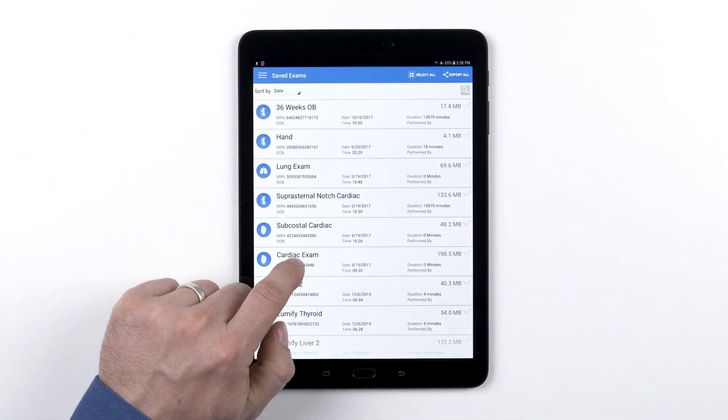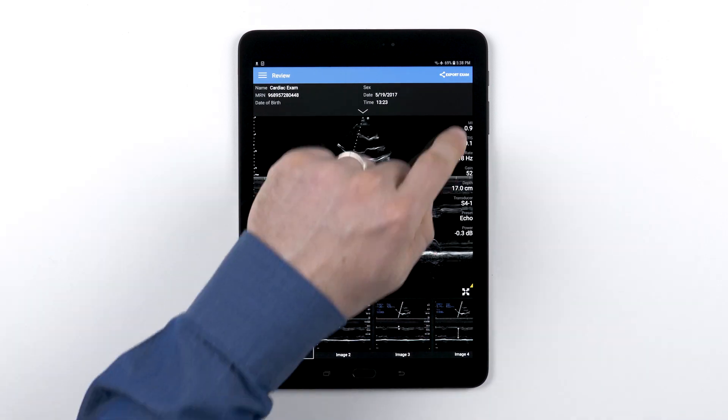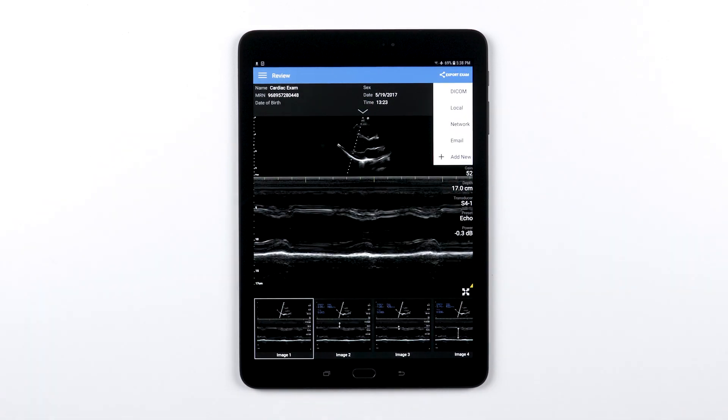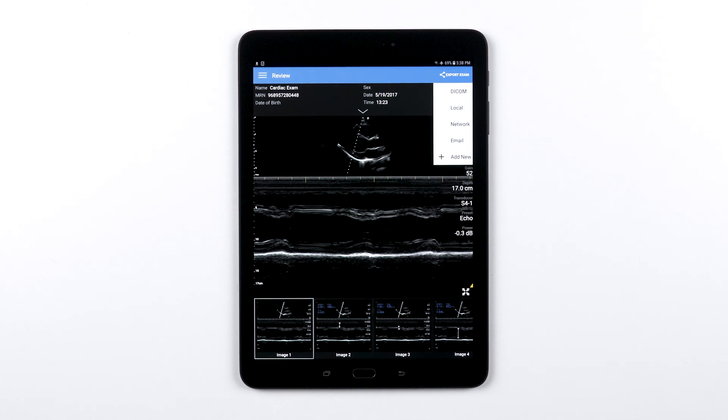Tap the export icon in the top right. You will be prompted to choose the destination you would like to use to export that exam to. This is where it's important to accurately name your destinations so you know which one to use.